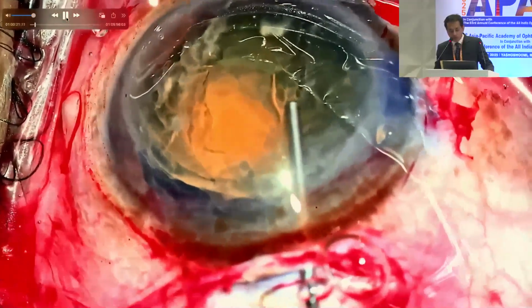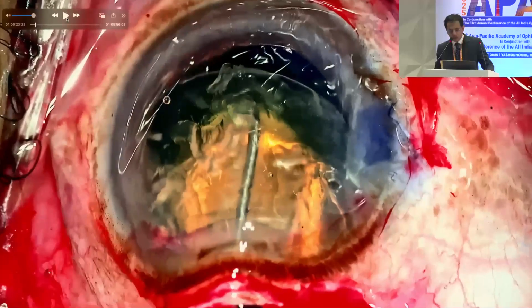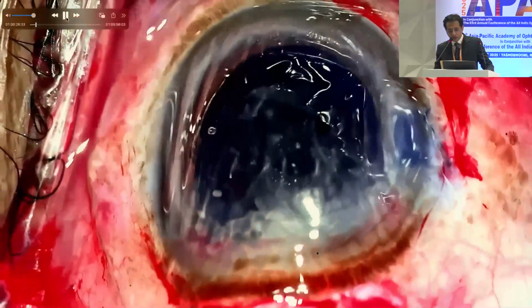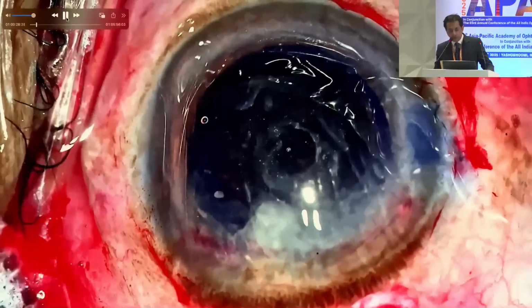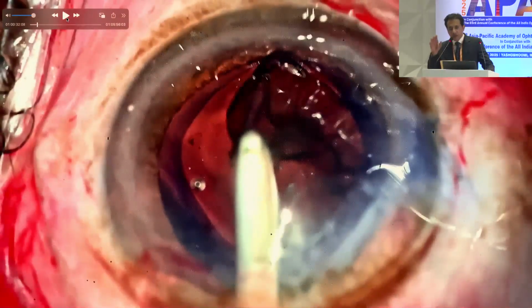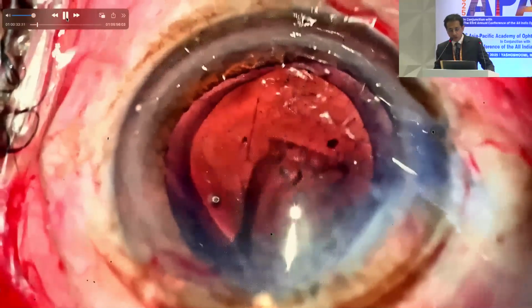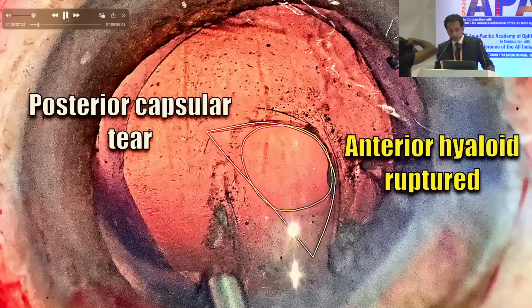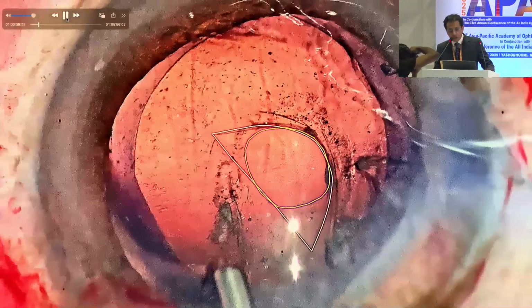Now, when we are going to pull the nucleus out, there is a momentary shallowing of the chamber, and this is when the posterior capsular tear can happen. This is what I experienced initially. That momentary shallowing is what causes your posterior capsular tear to happen. In this case, the anterior hyaloid was ruptured, but the vitreous prolapse had still not happened.